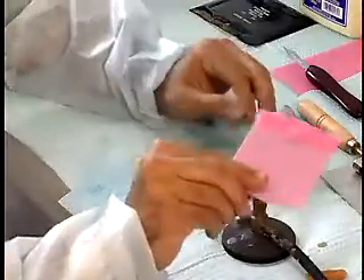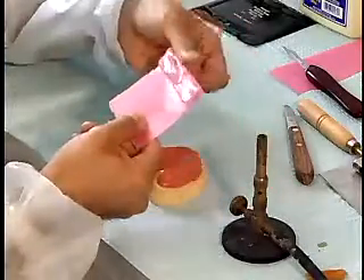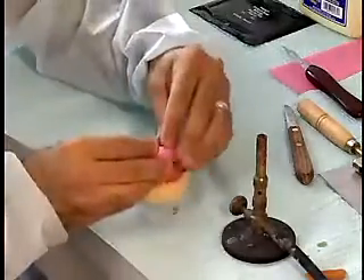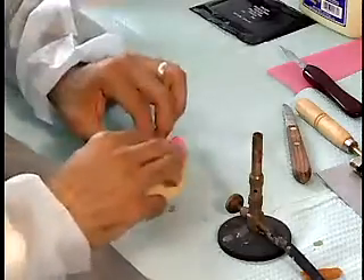Continue to flame the wax to soften it. Repeat the folding and warming until the entire sheet of wax is used. Form the wax into a horseshoe shape and adapt the wax to the record base.